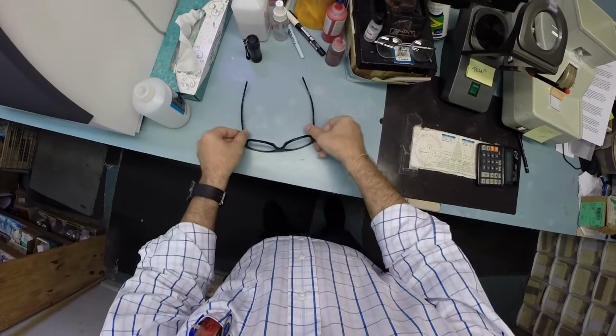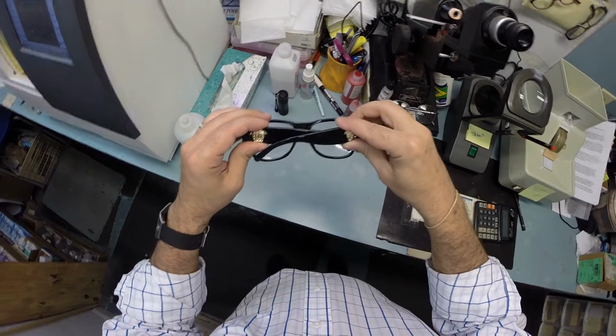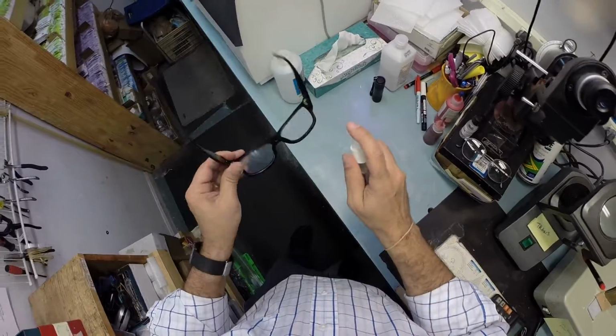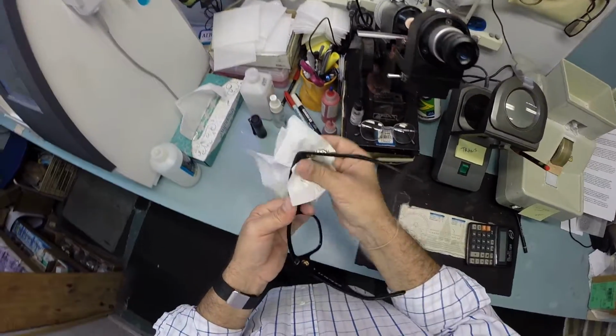All right, so I'm going to flip that over, press down. There is no wobble. I close each temple to make sure they overlap perfectly, and they do, and they're not askew in any way. Everything is lined up perfectly. Now, let me give these one good cleaning, and then I'm going to get these packaged up and shipped out to you so you get them in the mail very quickly.